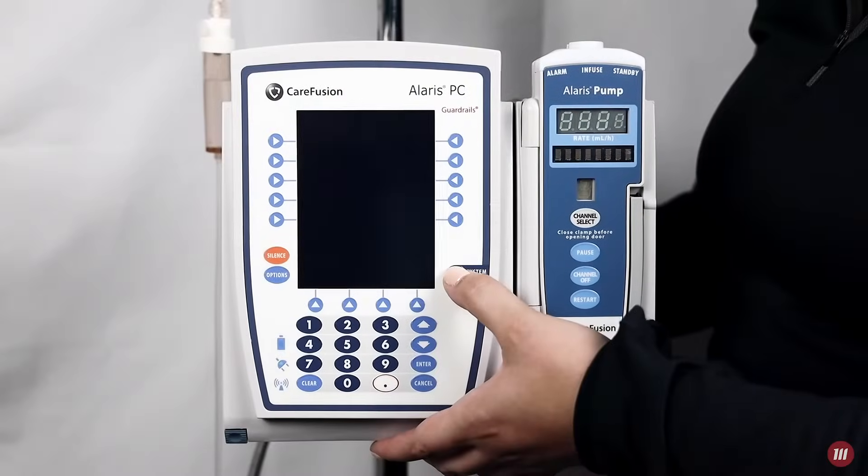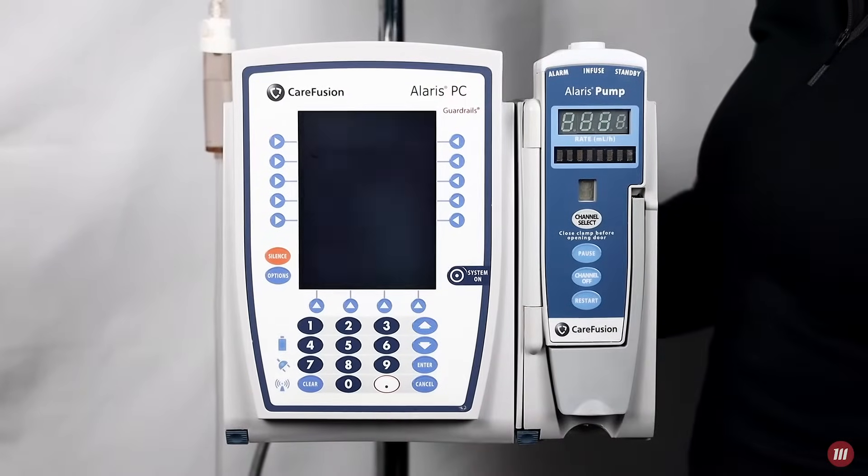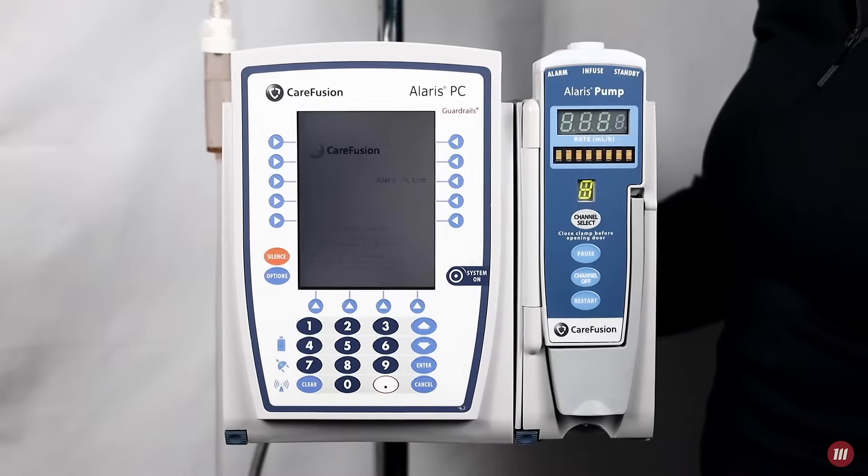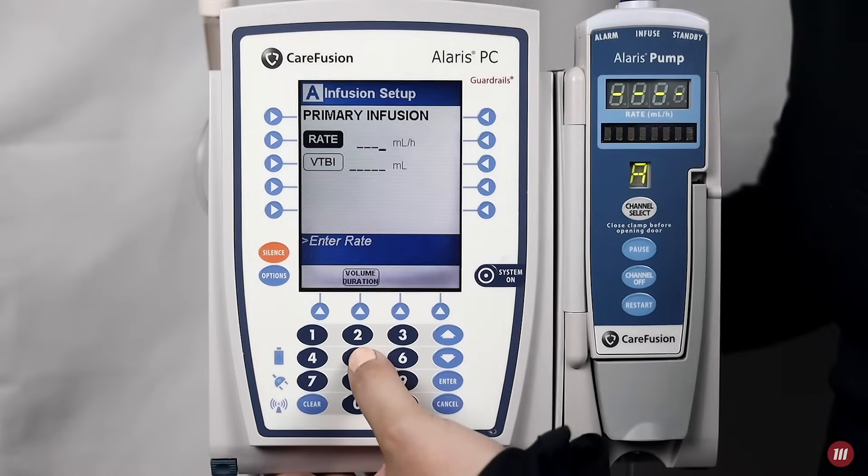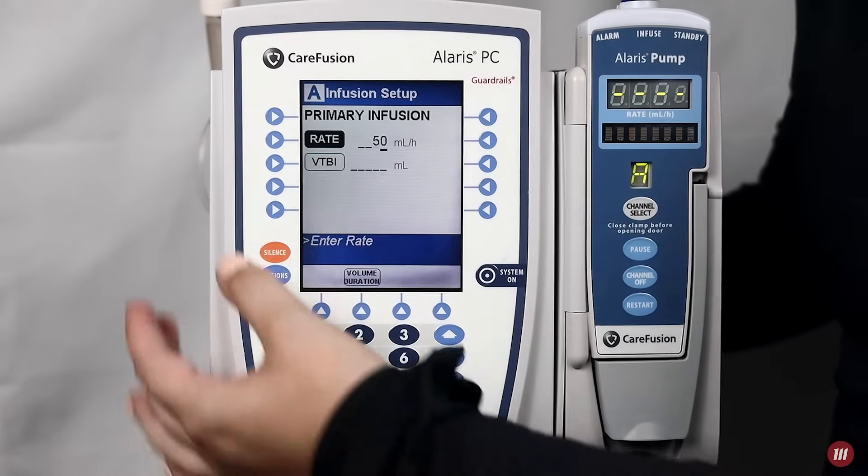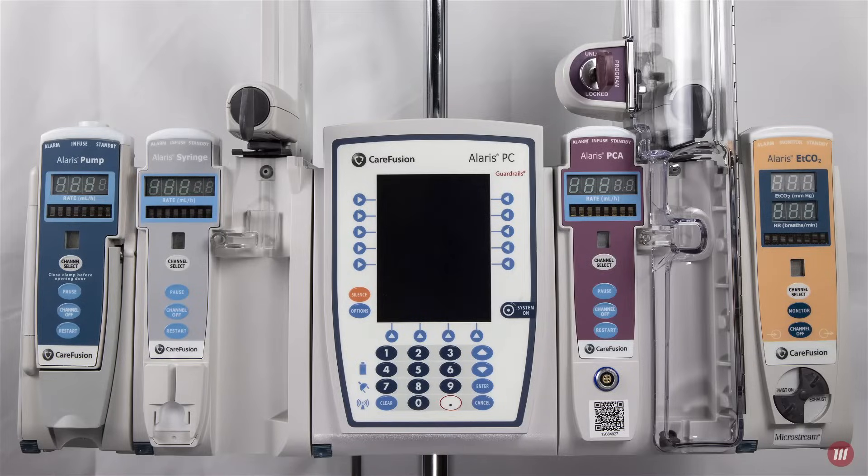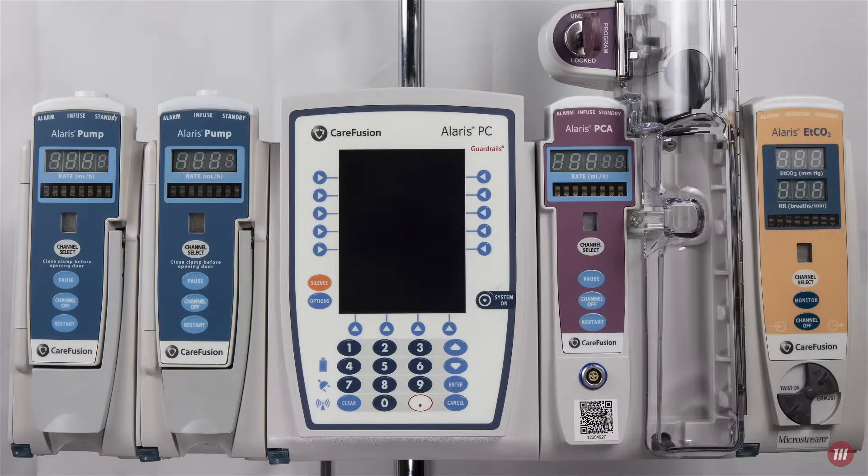The Alaris system can be powered through a wall outlet or through the internal battery that can last up to six hours. The easy-to-read screen and numeric keypad make it simple to program an infusion. Up to four modules of any combination can be attached to the PCU.